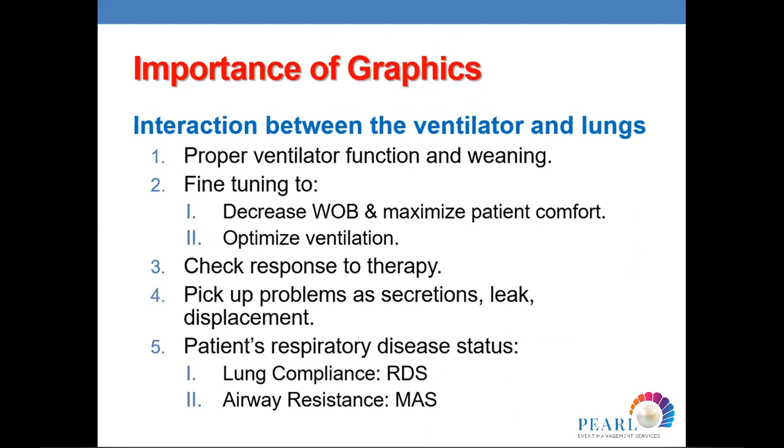So my outline for this lecture is, first, some basics about neonatal ventilation, which we already discussed in the workshop, but I'll just touch on it as an introduction to my lecture. Then I'll go through the graphics, the waves and loops, and how they look. Then I will go to the interaction between the patient and the machine. So, starting with the importance of the graphics.